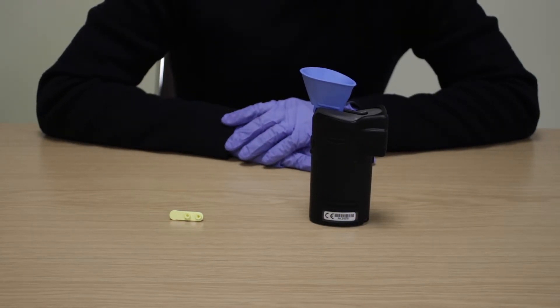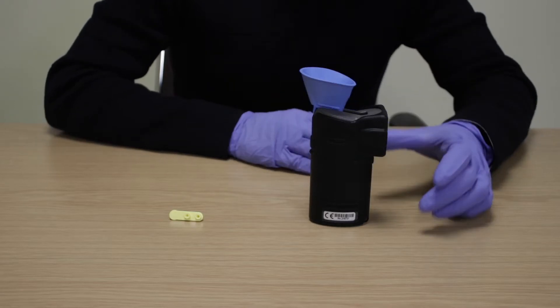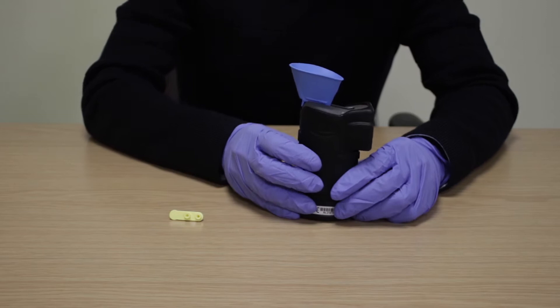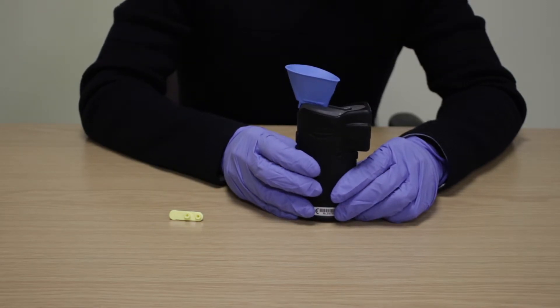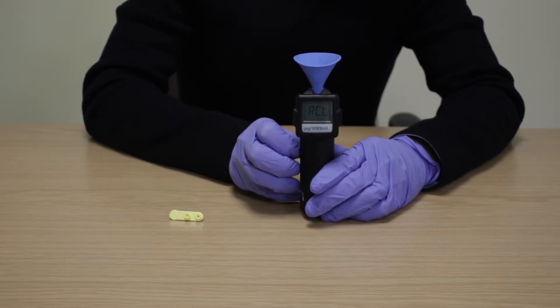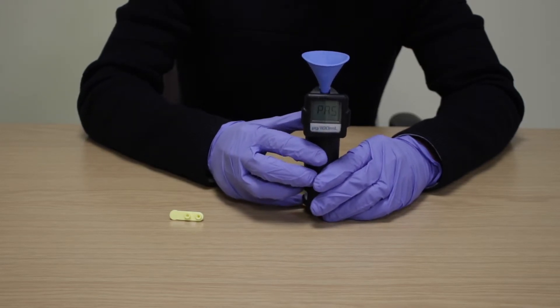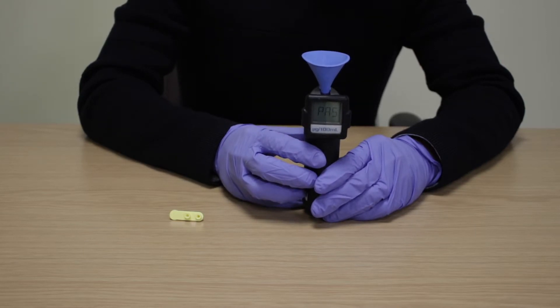Now press the on and off buttons together to bring up the menu. RCL will show on the screen as the first menu option. Press the on button to scroll through the menu until you see passive, then press the off button to select this passive mode.